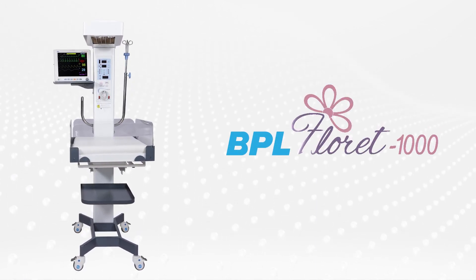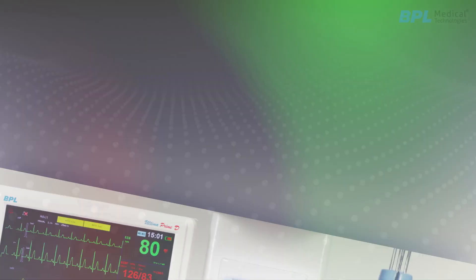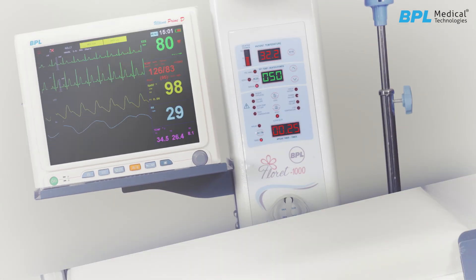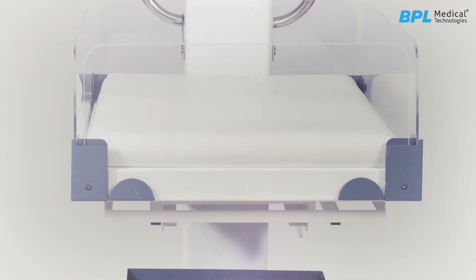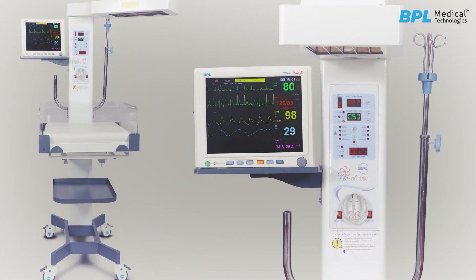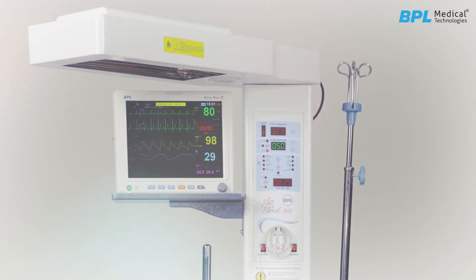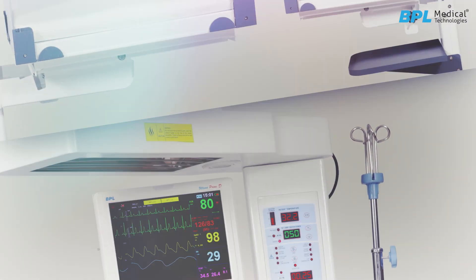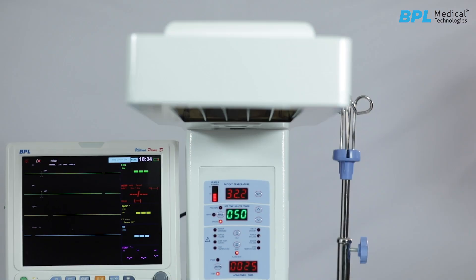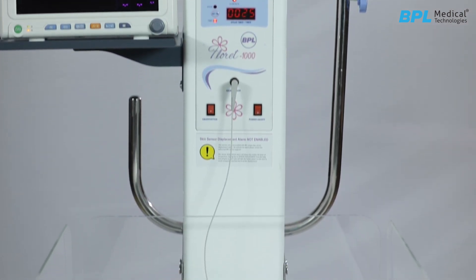Introducing BPL Floret 1000 Baby Warmer. The infant radiant warmer provides infrared heat to babies who are unable to maintain their thermoregulation due to their physiology. The warmer helps in the transition of the baby from the internal environment of the mother to the external environment, and plays an important role in improving the mortality rate of neonates.